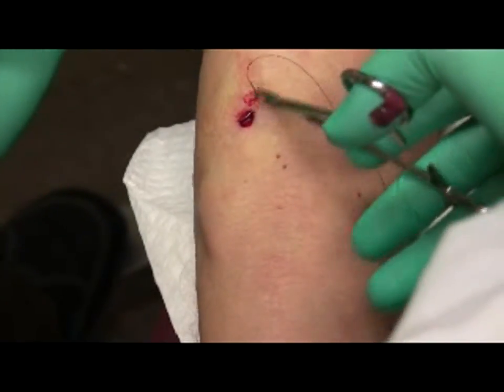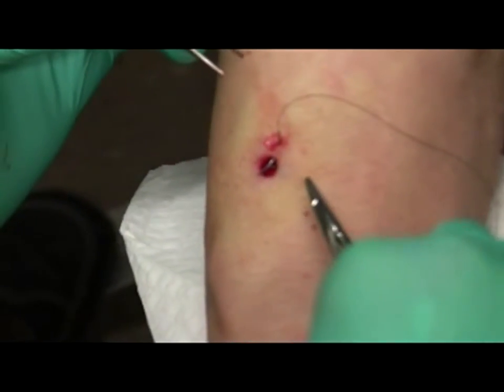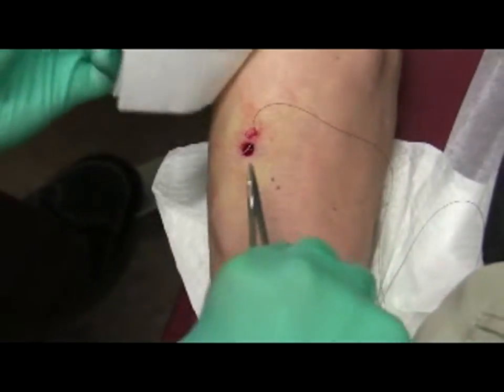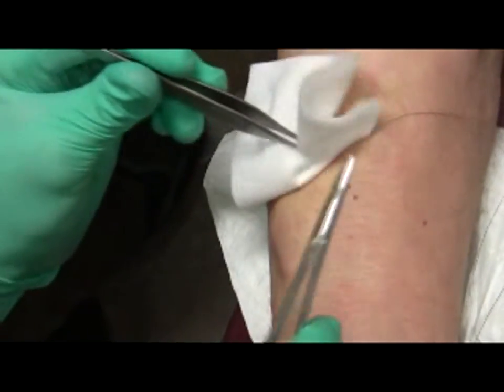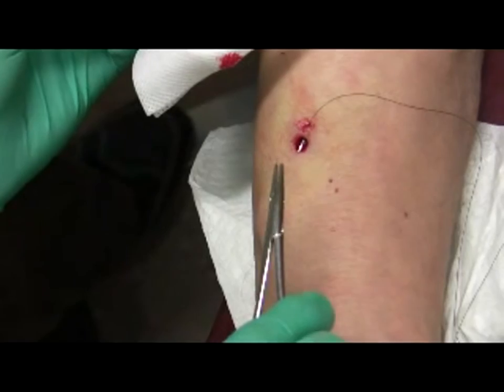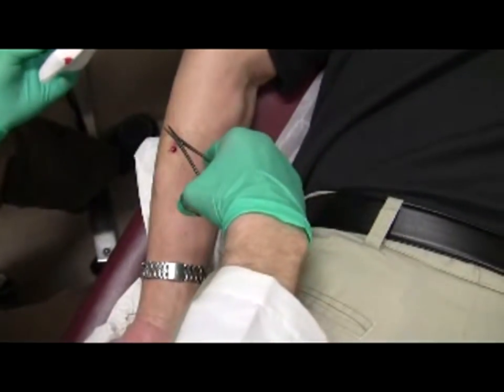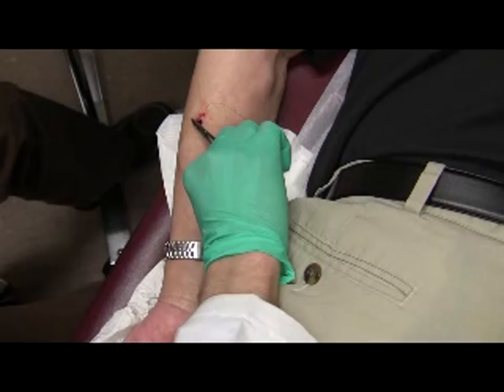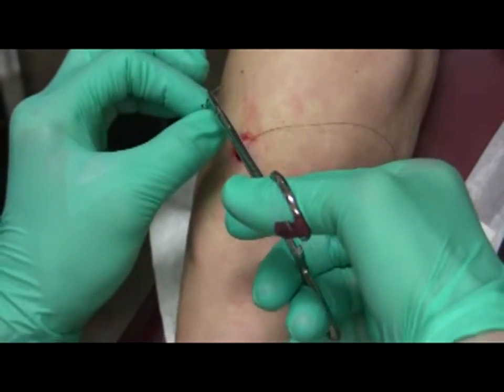Release the needle. The needle point should be sticking out of the middle of the defect — and it is. If bleeding, achieve hemostasis with gauze using an instrument to blot and not your fingers, because there is a needle point here and you'd stick yourself. Grab the needle point with the needle driver and pull the needle entirely through the center of the defect. Notice my wrist position — I twist my wrist before I grab the needle so that when I circle it out, it's in position to hand off at the blunt side of the needle.